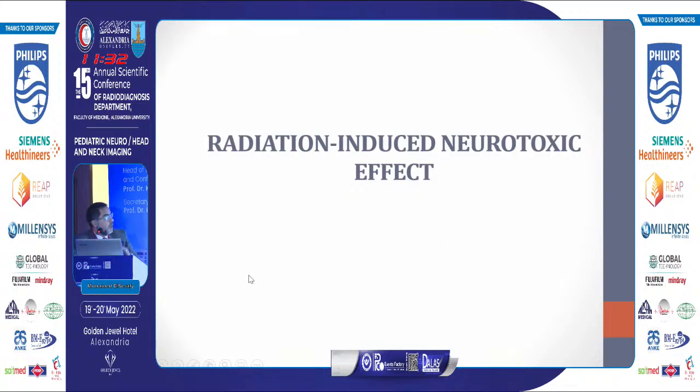The second part of this lecture is the imaging of radiation-induced neurotoxic effect.